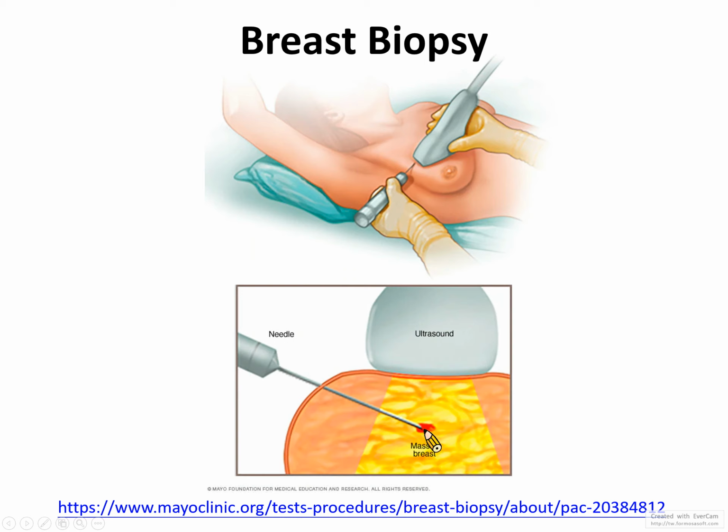So that is how we obtain the data sets we used in this course, and it is based on the core needle biopsy. Okay, but to ensure that the needle gets into the right place, you need ultrasound. So it is very technology driven. You need highly trained technicians or doctors to do this kind of job.